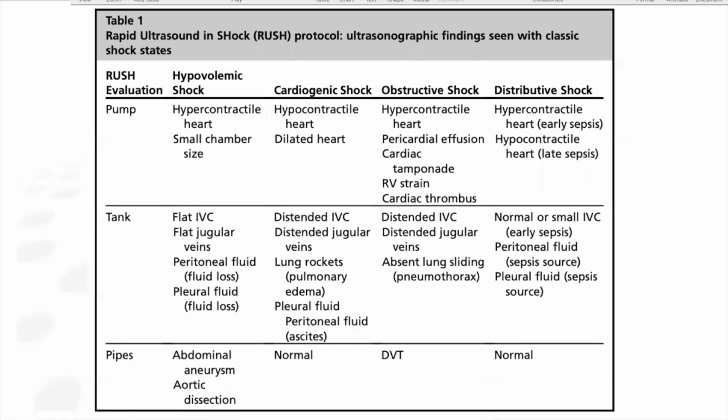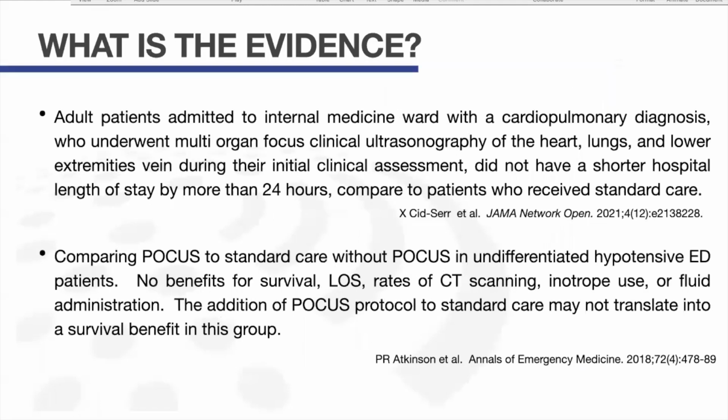So again, this is the summary of what I've shown on all the pictures. So what is actually the evidence on using POCUS in assessment of shock? Does POCUS actually help in your management, or does it actually change the patient outcome?